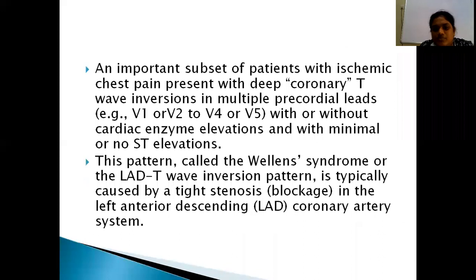An important subset of the patients with ischemic chest pain presents with deep coronary T wave inversions in multiple precordial leads, with or without cardiac enzyme elevations, and with minimal or no ST segment elevations. This pattern is called Wellens syndrome or LAD T wave inversion pattern, and is typically caused by tight stenosis in the left anterior descending coronary artery.